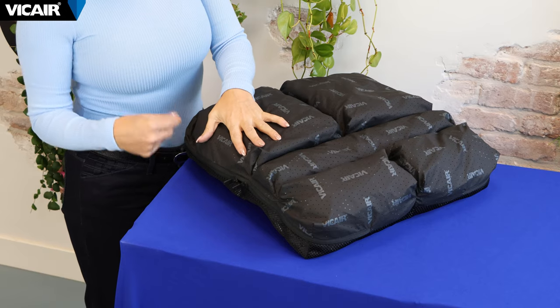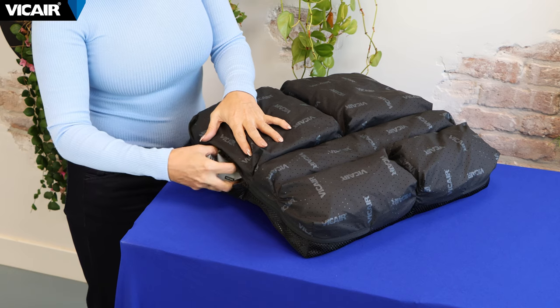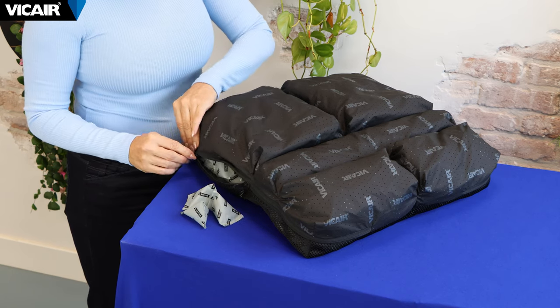For people with specific needs, the cushion compartments can be individually adjusted. It is simple to tweak the cushion — just take smart cells in and out of the compartments. It takes only minutes to set a cushion up optimally.